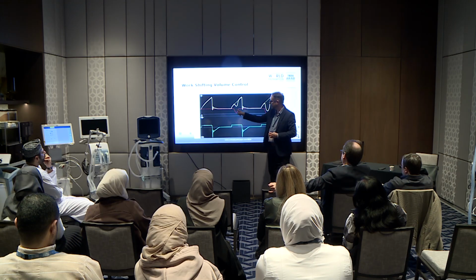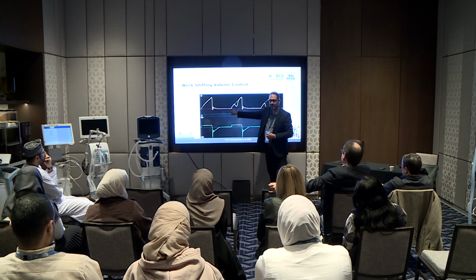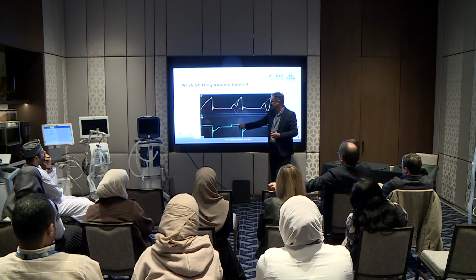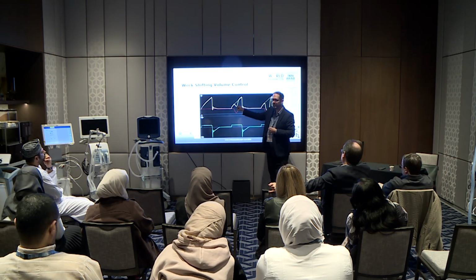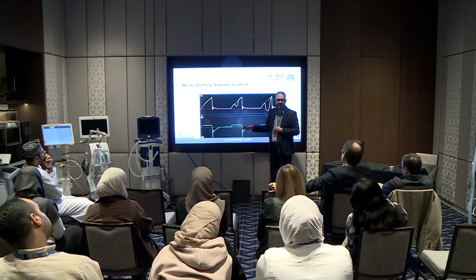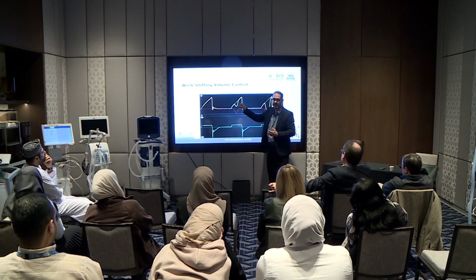If the patient is breathing during volume control, now this is actually reverse triggering. Notice they did not trigger. That's their effort here. There's a drop in pressure. And because flow is not changing, if it's not fast enough to meet the demand of the patient, you see a drop in pressure. If I was giving much higher flow, you may not see their effort in the pressure waveform. If the flow exceeds the demand, you won't see it. But if it doesn't, you're going to very clearly see it.